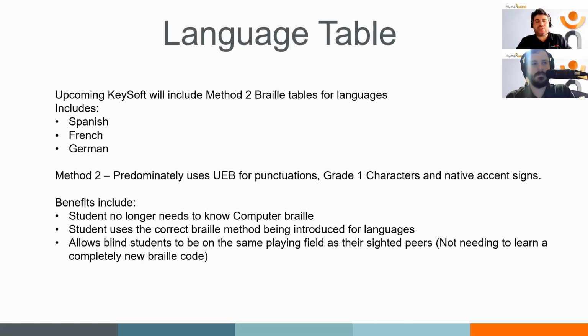A very good suggestion, Chris. Yes, you do have the option of save as, very much like in a word processor. If you'd rather do a save as shortcut, then you can, and of course then you can save it to whichever directory you prefer. It doesn't override the main file. Space with S would be save, where you would just save any of your changes. Backspace with S would be save as, where you can then modify the name or the storage path.